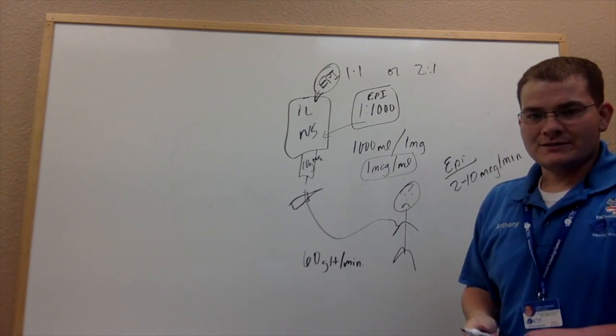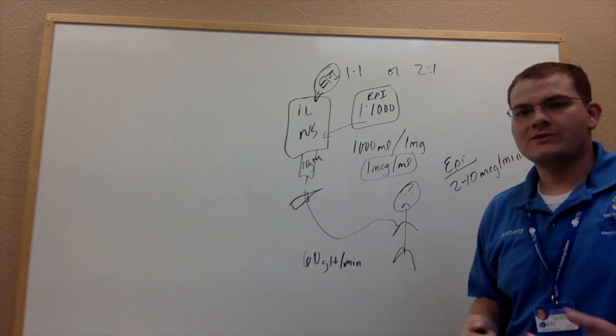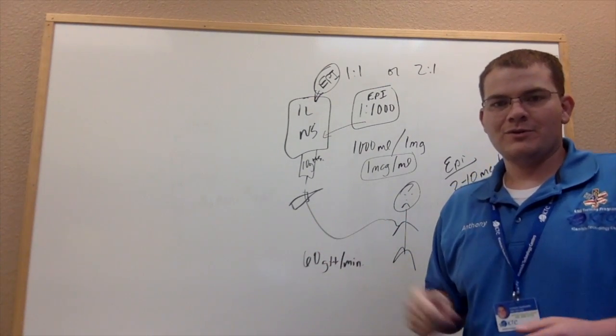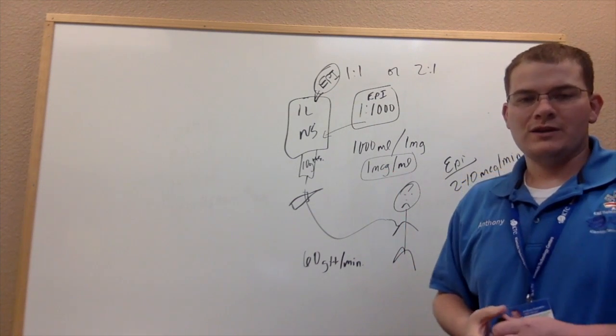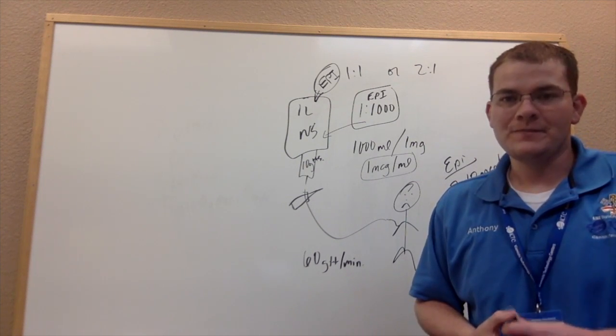Whenever I use this, it's post-cardiac arrest patients. It's in the house. I don't have my dopamine with me. I don't have 60 drop sets. I just need to mix something up really quick. So I mix up this 1 to 1, dirty epi drip, whatever you want to call it, and get it out to the patient really quick so that we can perfuse on the way to the ambulance before we can hang on a more long-acting drug. Or we'll keep this one if it's working for us once we're on the way.